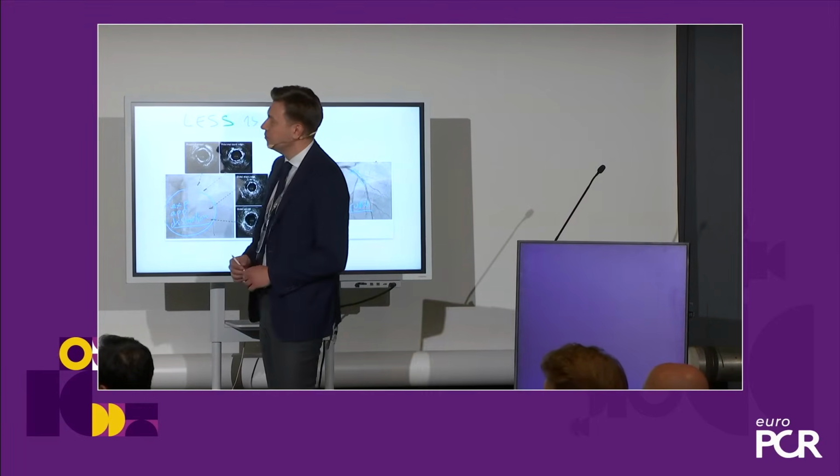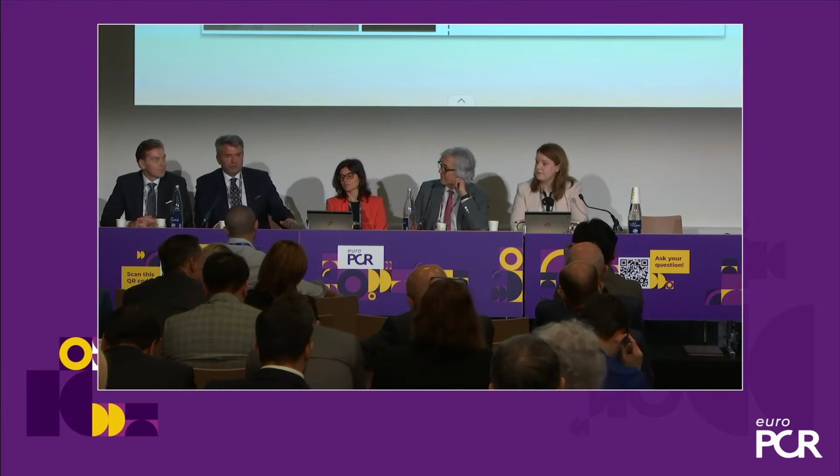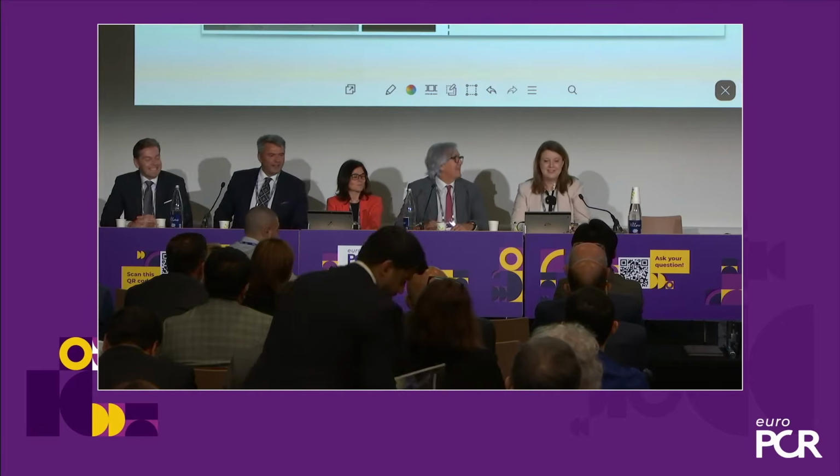Would you like to answer that? I think that, right, there are some controversies, that the more contrast is not necessarily so bad. There are some opinions. Others say, as we know, that it could have an impact. But in general, as Dejan presented, when you use more technologies, we know that they improve the PCI outcome. So if you use more ultrasound, more FFR, your PCI by itself is better. And at the same time, you can reduce the contrast. So I would say that contrast is not the only focus. I agree completely. I changed the colors, so I think you can appreciate it better now.